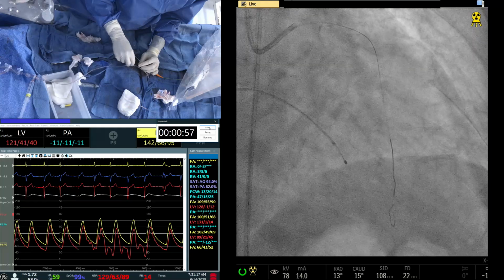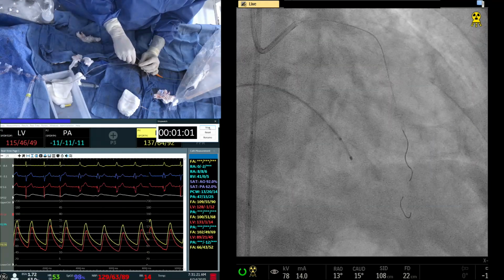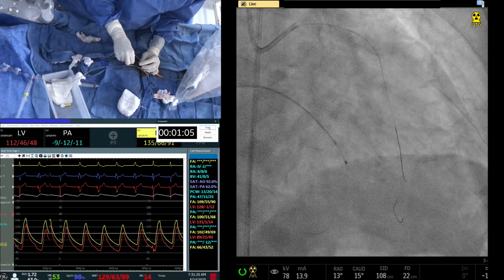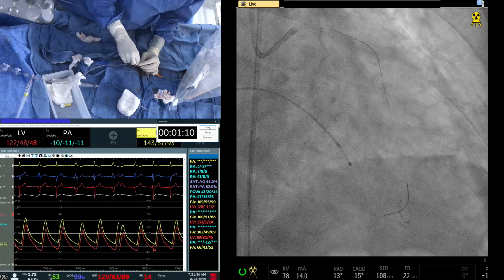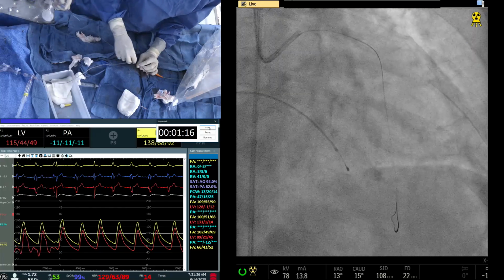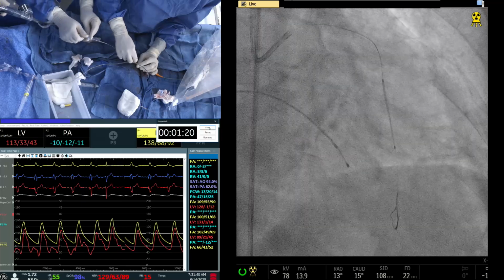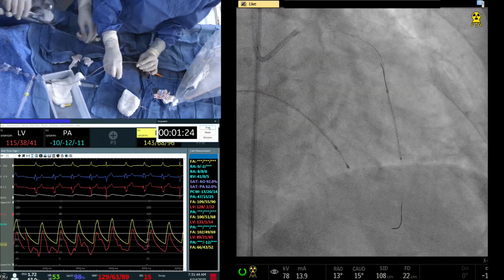And when we do the imaging, sir, probably we can also image the circumflex because maybe we can leave it alone. It looks quite okay. There will be nothing wrong in that, believe me, if you leave the circumflex. That's why I said, usually we say double stent strategy, but not in this particular case, because of the age, 55 and on. And not only that, he'll require only single antiplatelet therapy. And of course we'll be on warfarin.